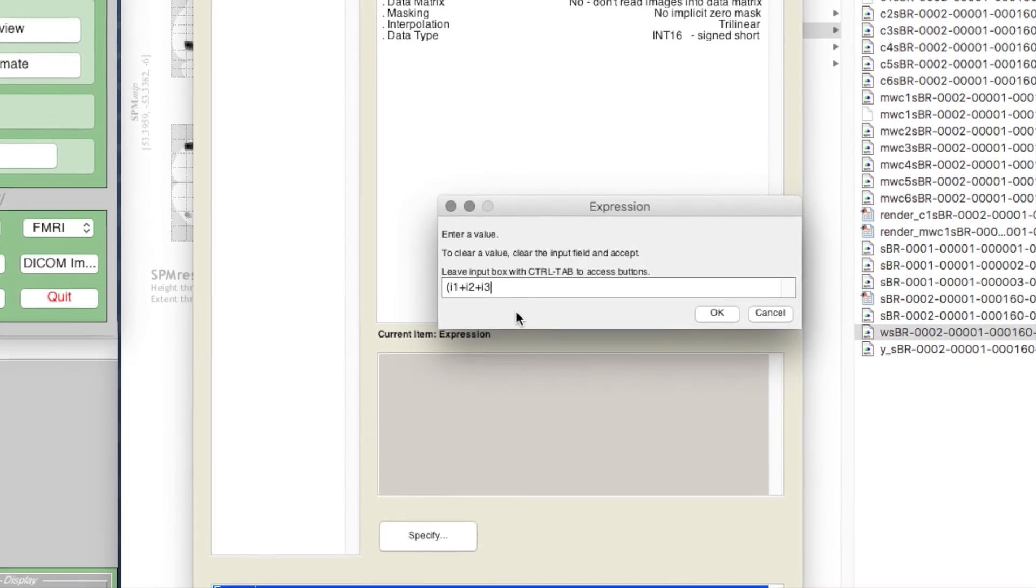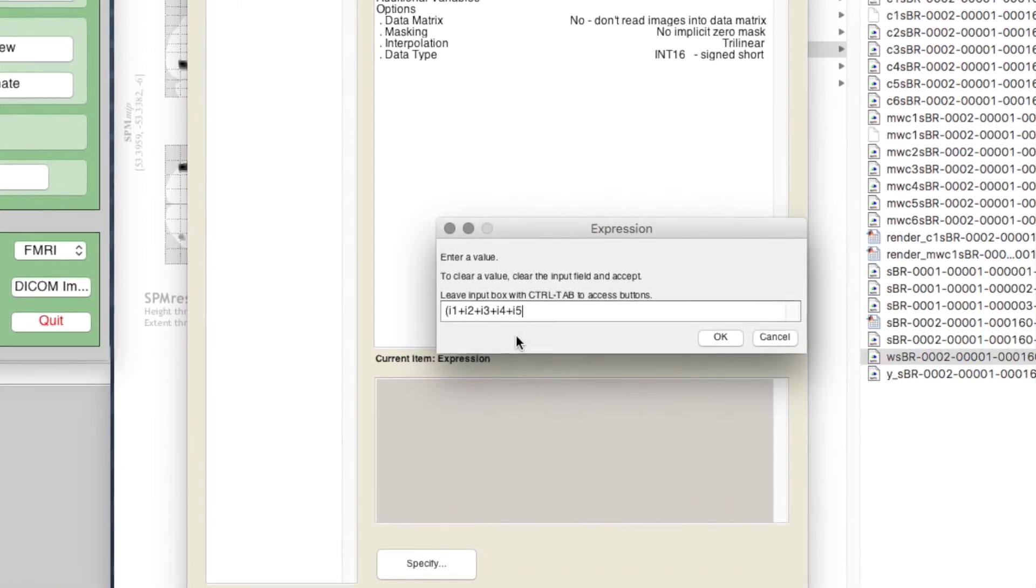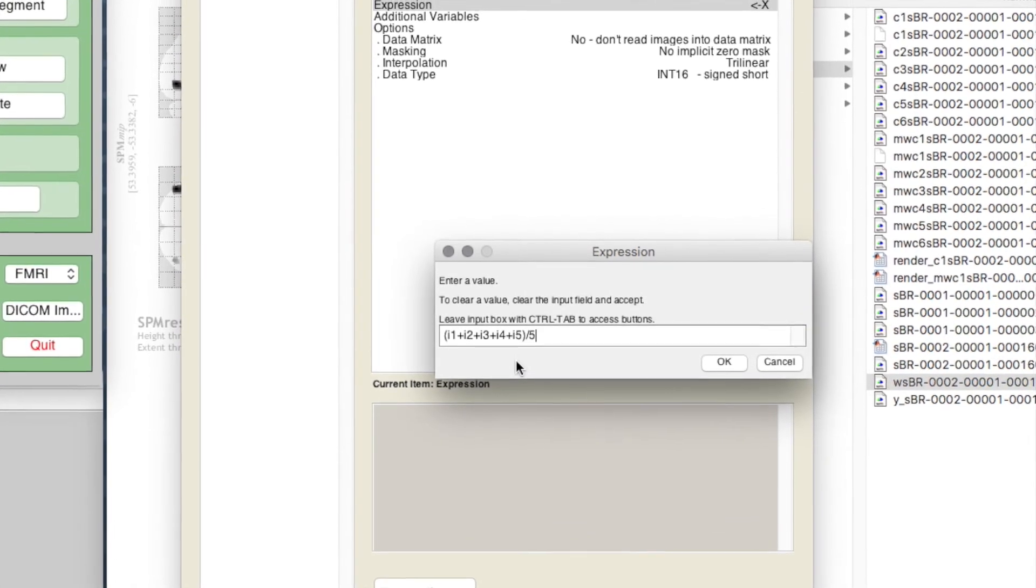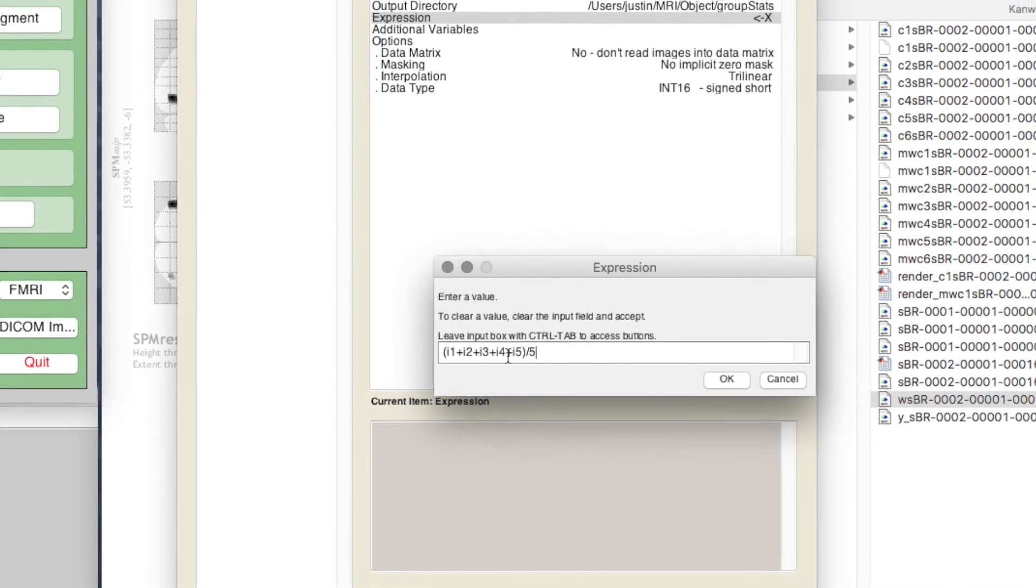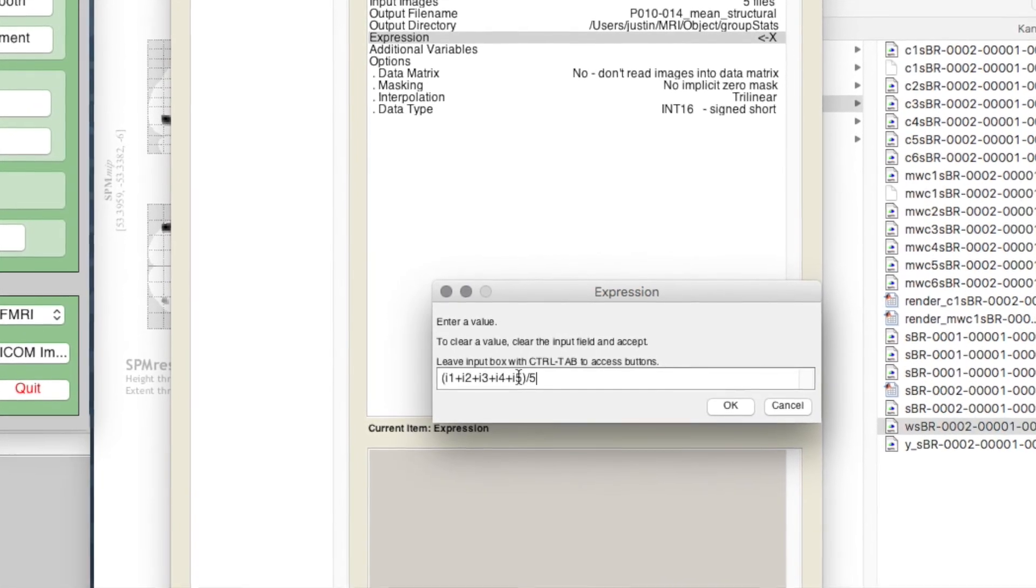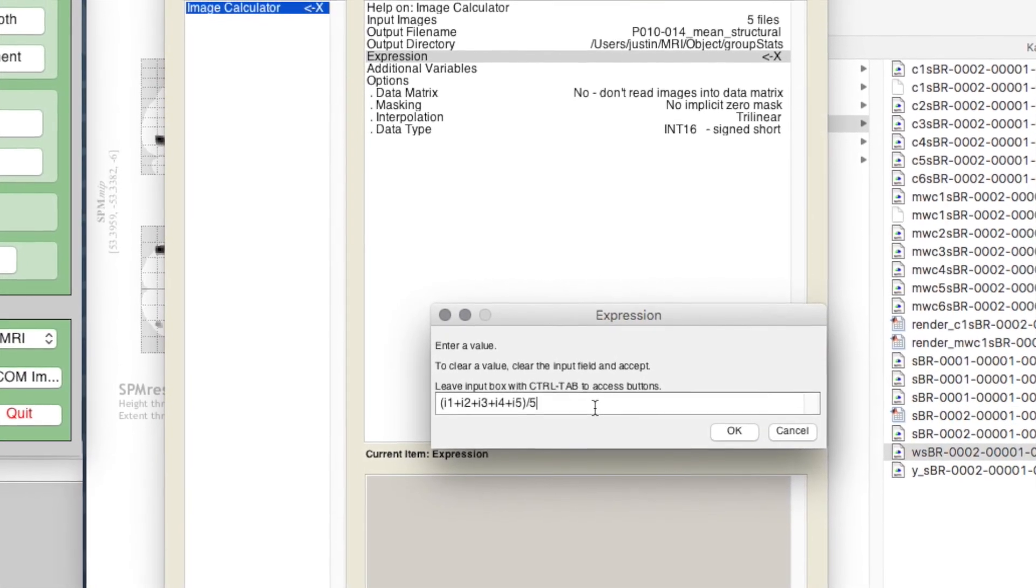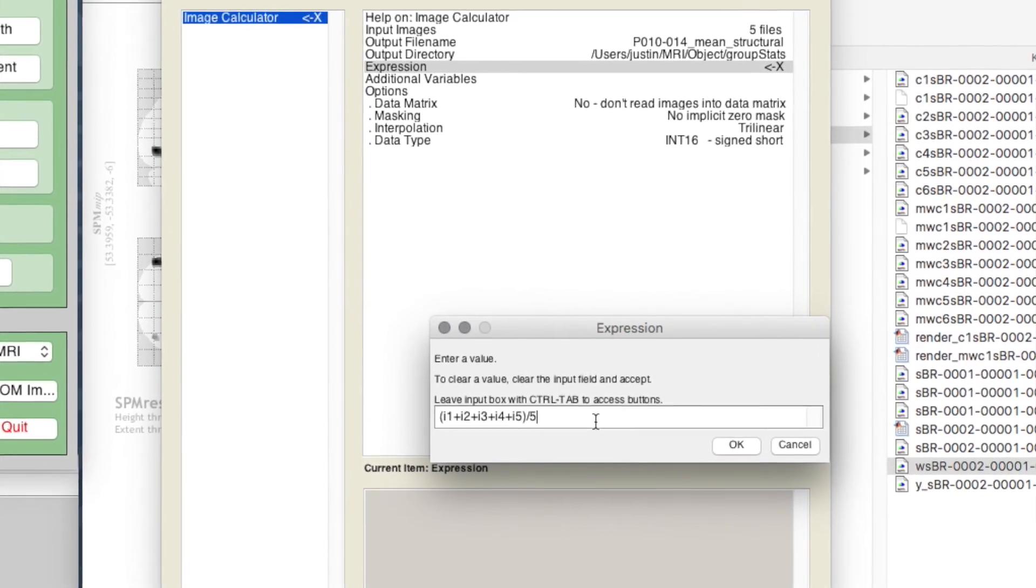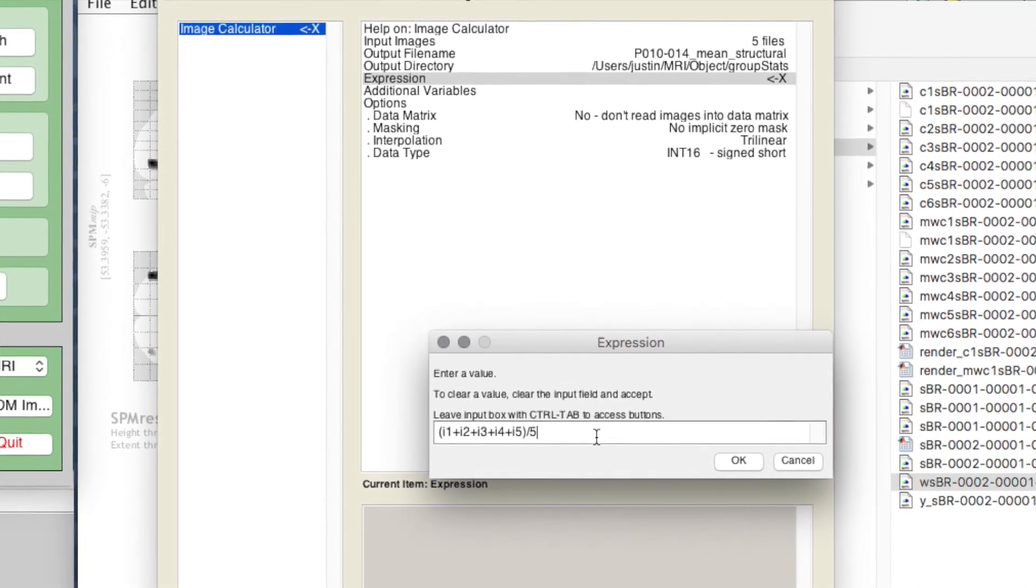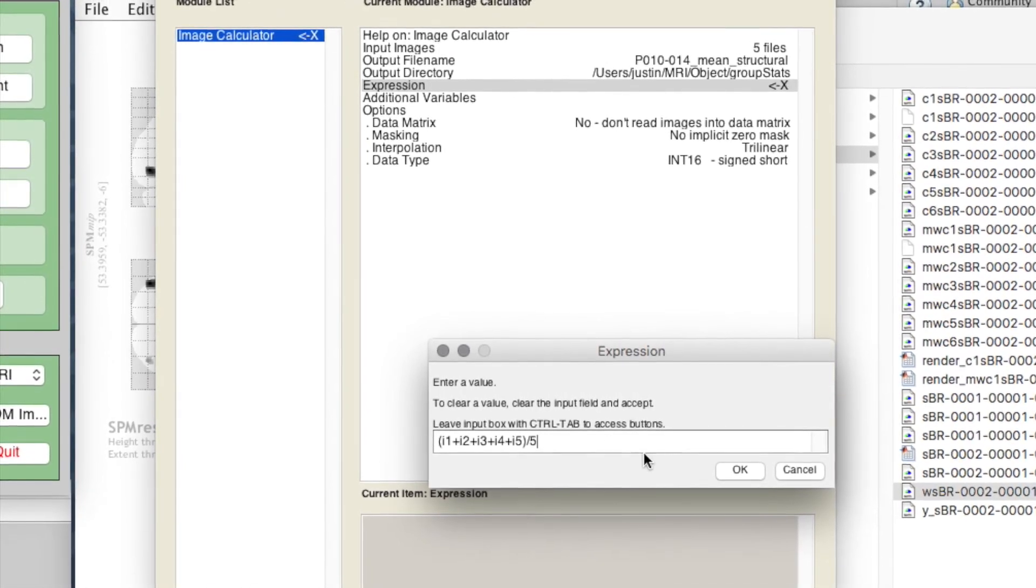As long as i1 up to i5 is all in brackets, it'll sum those and then divide by five and we'll get the mean. You could also do 0.2 times i1 plus 0.2 times i2, etc., but this will work. Let's click OK and that should be fine. Additional variables: none.